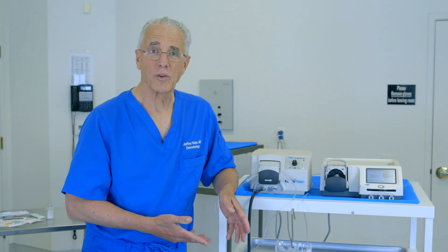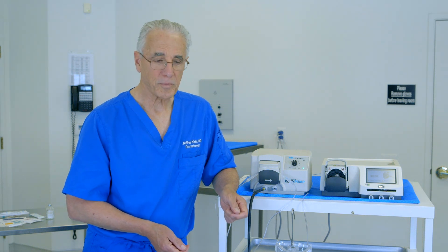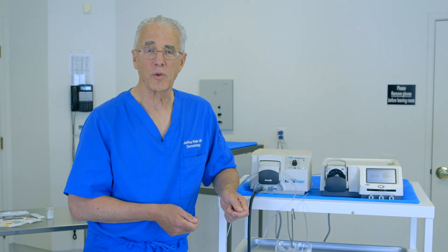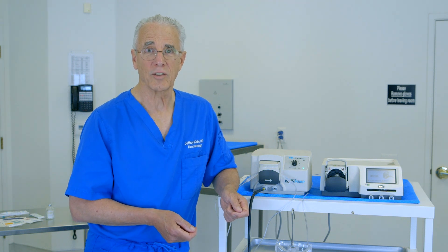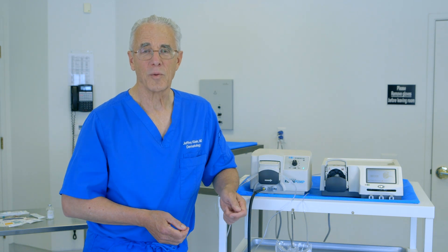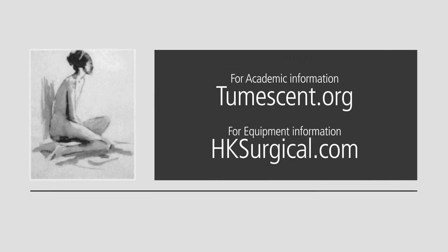I've had the opportunity now to show you the device components of tumescent local anesthesia. It consists of a peristaltic infiltration pump, then the tumescent infiltration tubing, and finally the tumescent infiltration cannulas. Put these together and it provides painless, large volume tumescent lidocaine. For more academic information about tumescent lidocaine anesthesia, go to tumescent.org. For information about the surgical devices and tumescent infiltration equipment, go to hksurgical.com. Thanks.